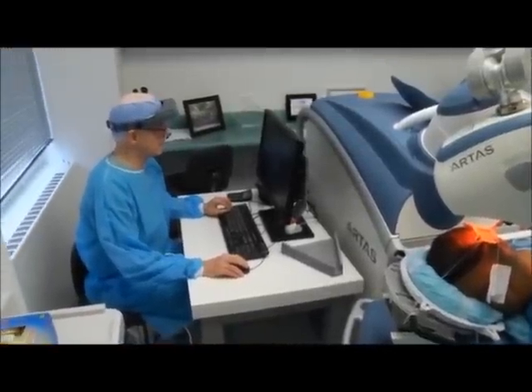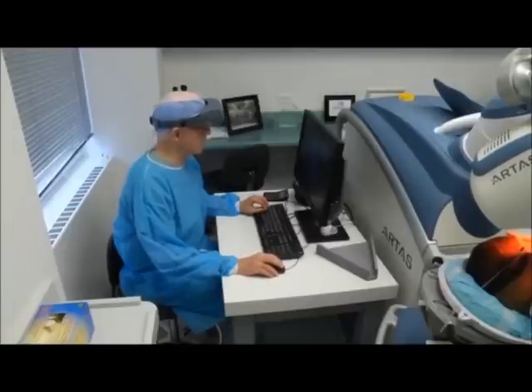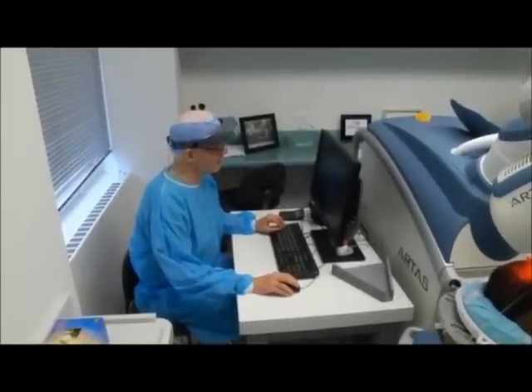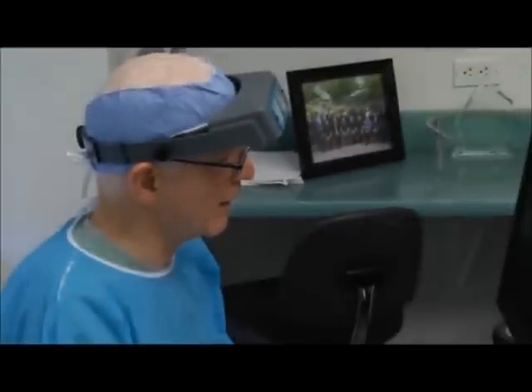The operator will skip over areas where there's scarring and make slight adjustments to depth if necessary, but the robot is pretty much on autopilot at this point. The green dots indicate how many hairs are in each follicle unit, so you can see it's going for all the twos and threes and skipping over follicle units that have only one hair.